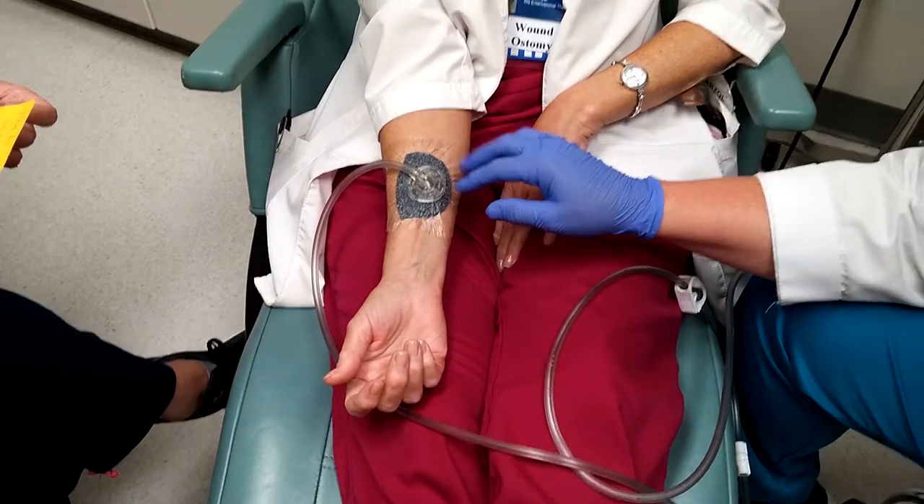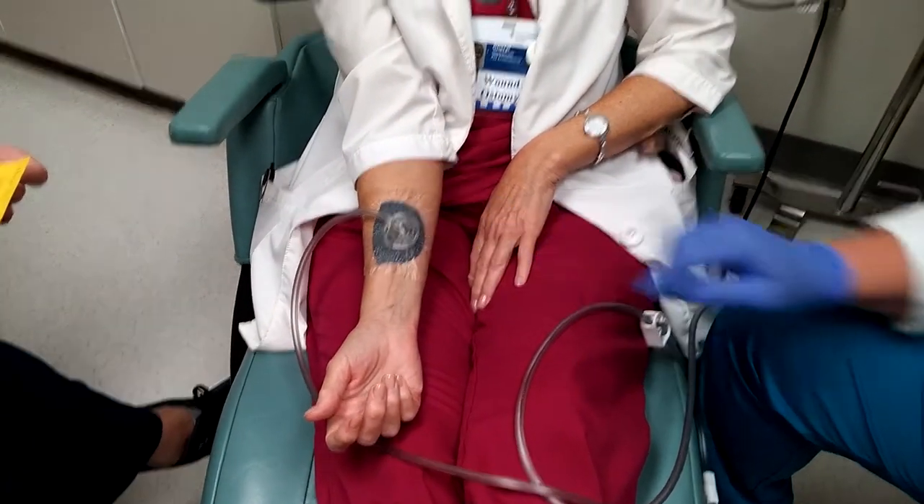If it's filled up, you need to think about whether it's got a good seal.